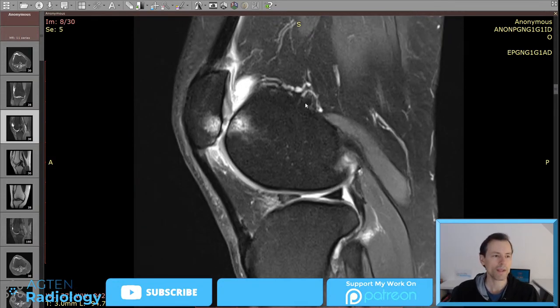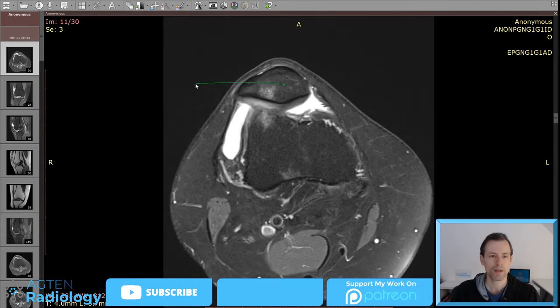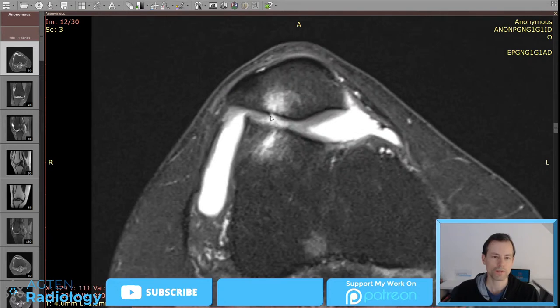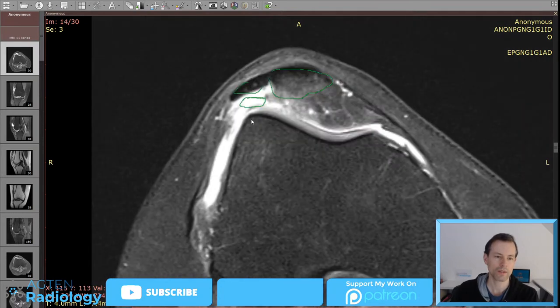Now, the reason why he has this is also, in this instance, a little bit more obvious than usually. We have the trochlear groove here, the patella is lateralized and is riding just over the lateral facet of the trochlea. And then we have all these cartilage damages, as you can see here. So this is a deep cartilage damage. We have a very obvious cartilage damage also here, and then the adjacent bone marrow edema, or bone marrow edema lesion, if you will. So this is the femoropatellar osteoarthritis, together with this supralateral Hoffa impingement.